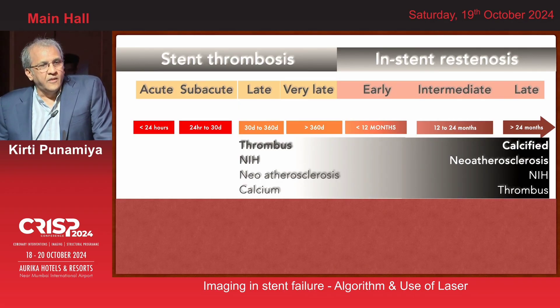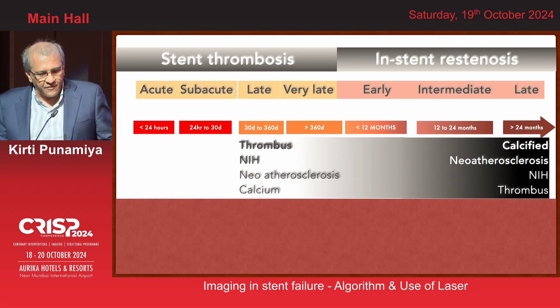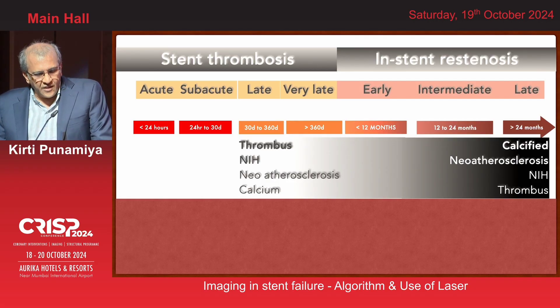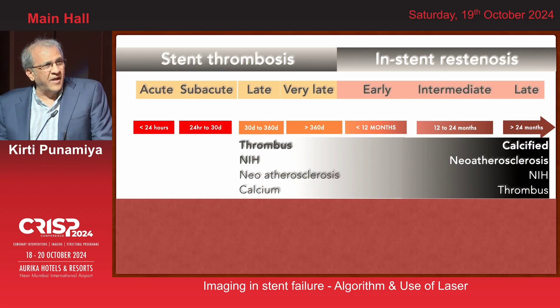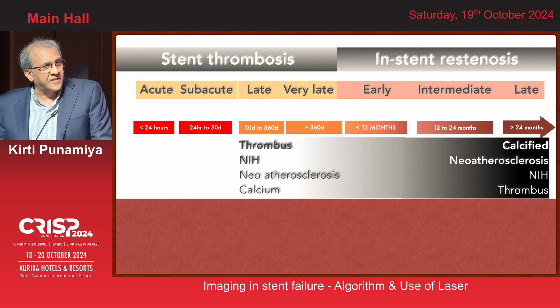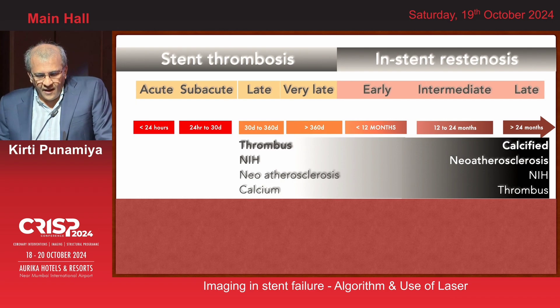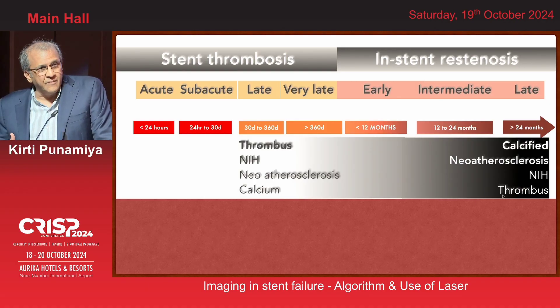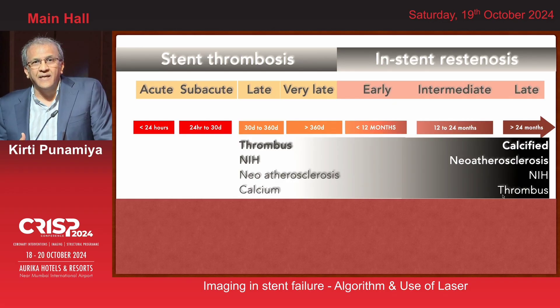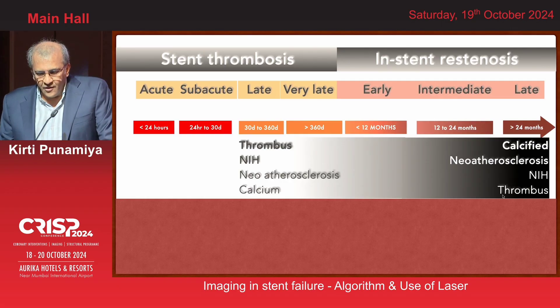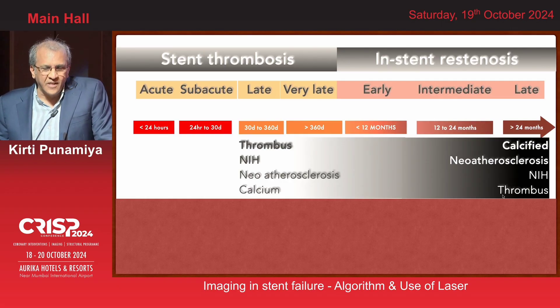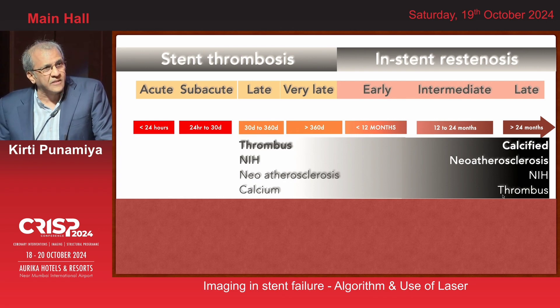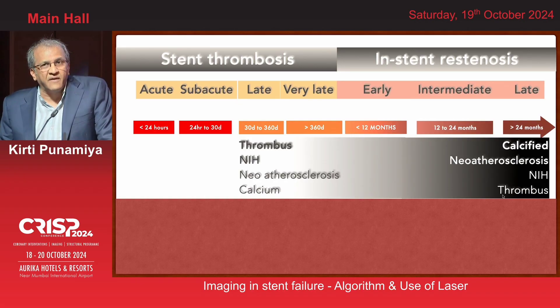When you talk of late and very late stent thrombosis versus early in-stent restenosis, on the left-hand side you see more thrombus, you see NIH, new atherosclerosis beginning, and very little calcium — almost always on the outside of the stent due to underexpansion. As you move toward intermediate and late ISR on the right of the curve, calcium becomes predominant within the stent. Beyond 24 months, it is almost a rule that in all ISRs you will see calcium within the stent. New atherosclerosis is seen, and there is organized thrombus of various levels that behaves like fibrous tissue.